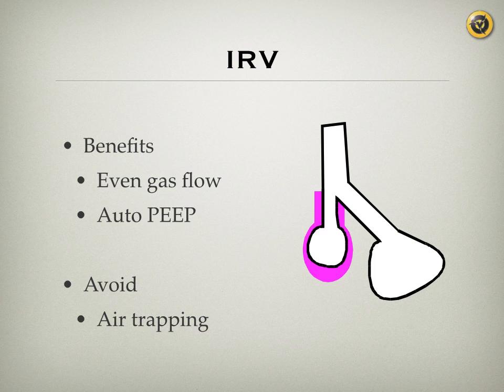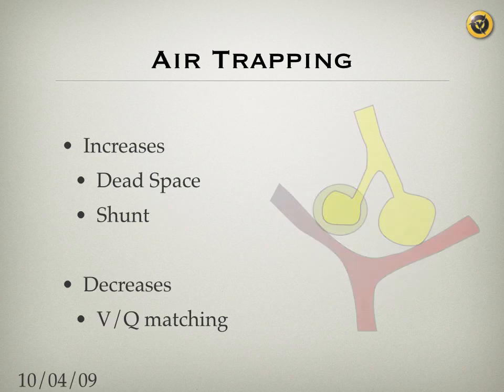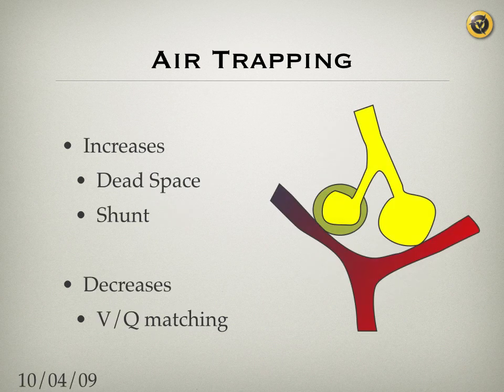One other important point I would like you to notice here is that sometimes we apply either additional or more than the required PEEP, and that's also harmful to patients. If you're applying PEEP to a patient with multiple stiff units, that PEEP will basically disseminate into the wall of the alveoli and not be transmitted to the capillaries.